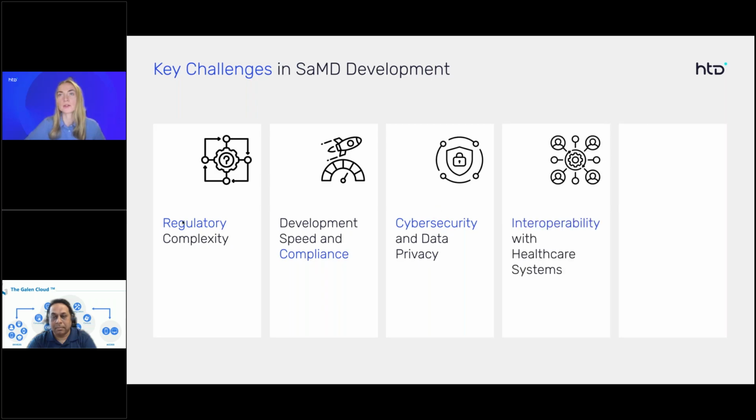And then one of the key challenges is interoperability. Interoperability is not just nice to have, it's a must-have feature in your device, because you shouldn't have a device that acts in silos. The devices must be connected.